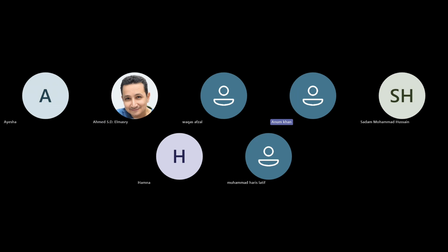Okay. So the more damage will be coming because of this external pump that will be left there when the balloon is ruptured. Yeah, exactly. The more damage due to hemodynamic instability. And I think, if there is evidence of balloon rupture, the intra-aortic balloon has a safety setting, it will go to the standby mode, right? Yes, exactly.